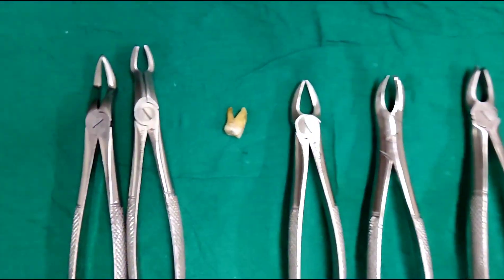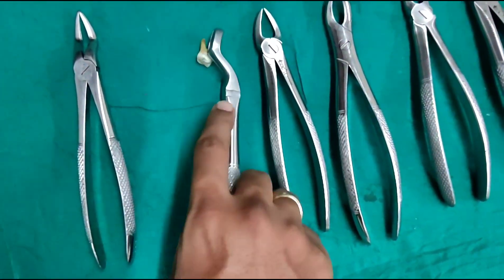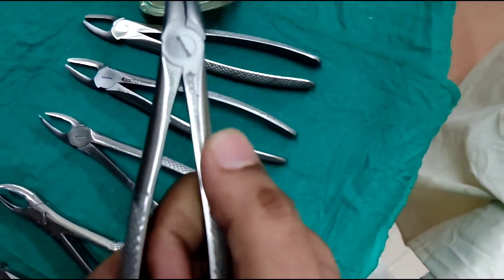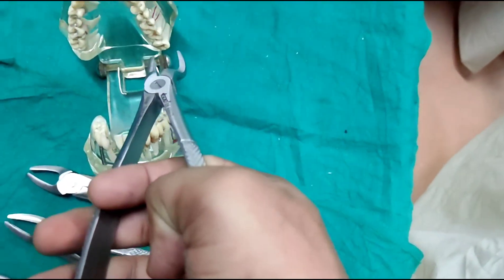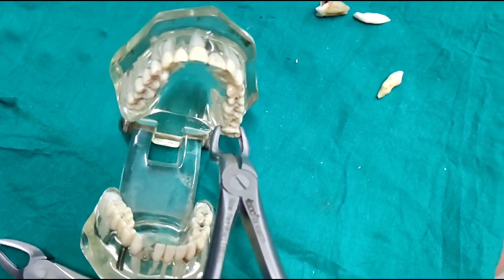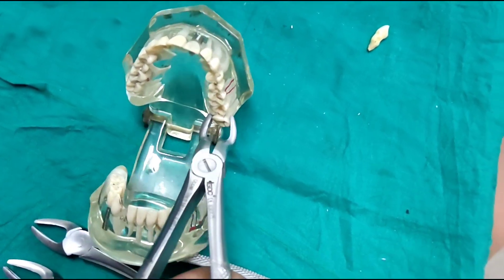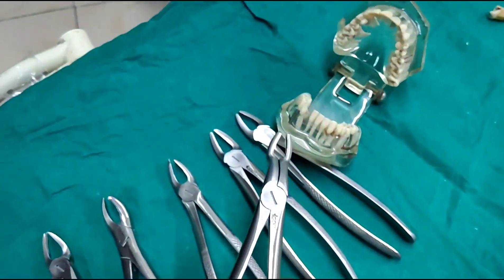Now coming to the third molar forceps. This has a longer handle and also a longer beak; the beak curves at an angle. This helps in giving reach to the third molar because it is difficult to access. With the use of the longer handle and the longer beak, you can access the third molar easily, grip it a little deeper into the tissue — which cannot be shown on the typhodon teeth — and then give the required movements. This makes it much easier to access the third molar and get it extracted.